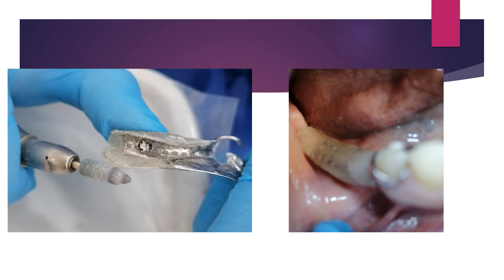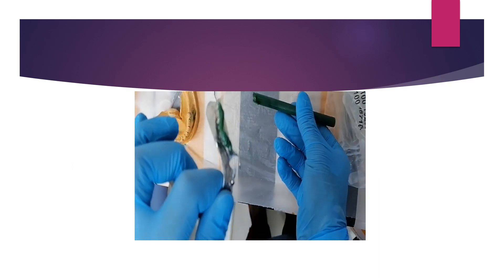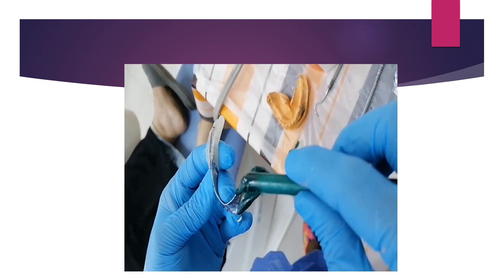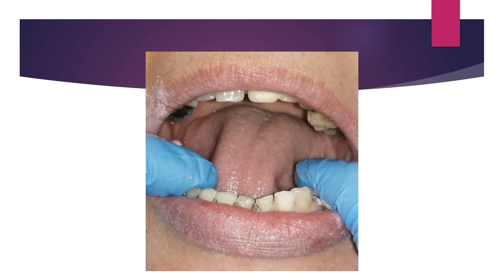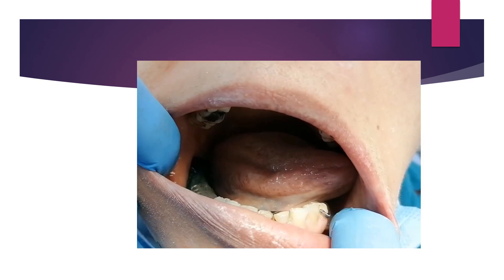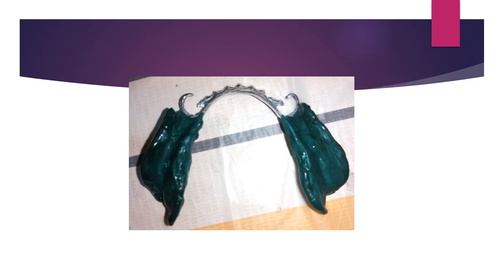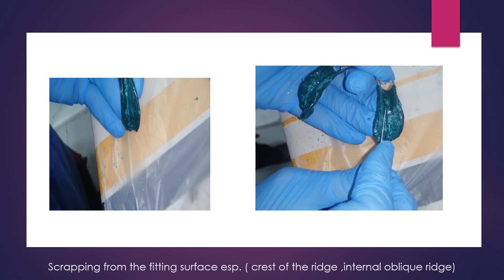Finish the borders and confirm they are all 2 millimeters shorter than the full depth. Make perforations in the mesh work area of the tray so that excess zinc oxide eugenol can escape. Try it in the patient and confirm all borders are indeed 2 mm under-extended from full depth. Add compound to the borders and fitting surface and press in the patient's mouth. Soften the green compound and begin trimming in the patient's mouth, always pressing on the framework at the rest seat on both sides during trimming. Confirm all flanges are clear.